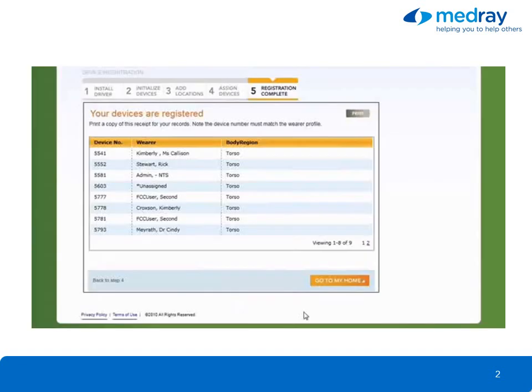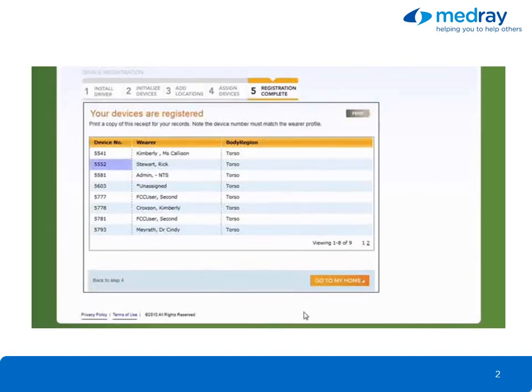Registration is now complete. From this screen, you can print a list of the devices in your account. Remember, the device number must match the profile of the wearer. Click Go to My Home to be directed to your home page.